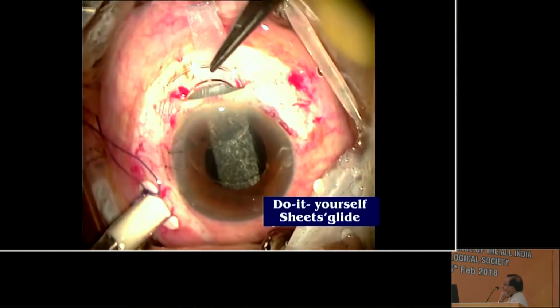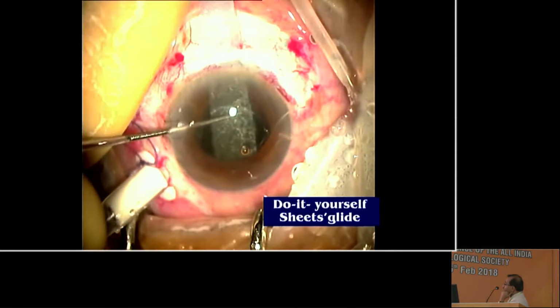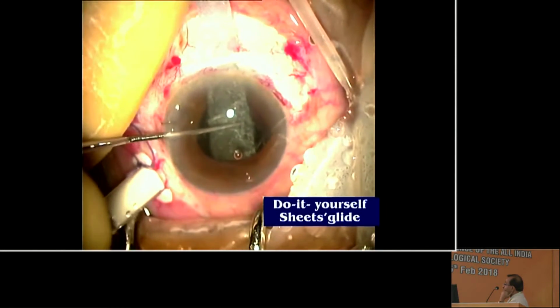This do-it-yourself sheets glide can also be used for safe placement of a rigid IOL in the sulcus when the PC rent is large.